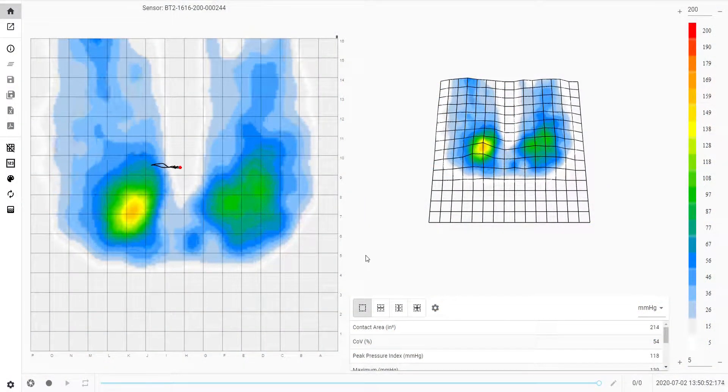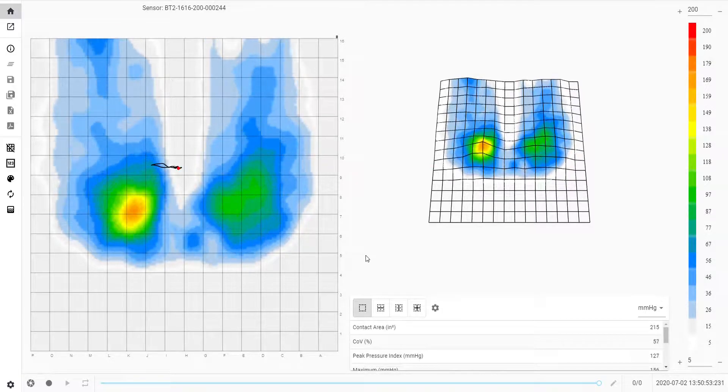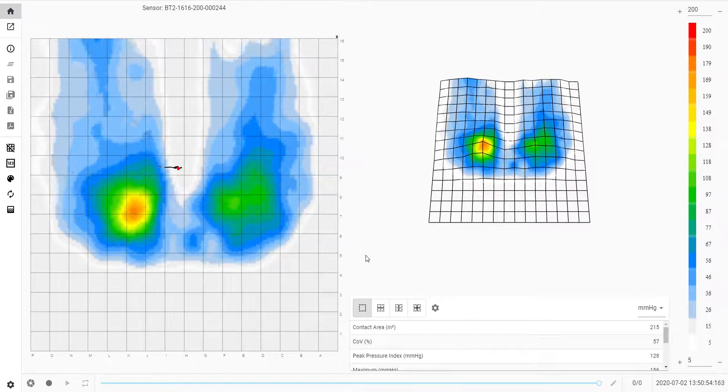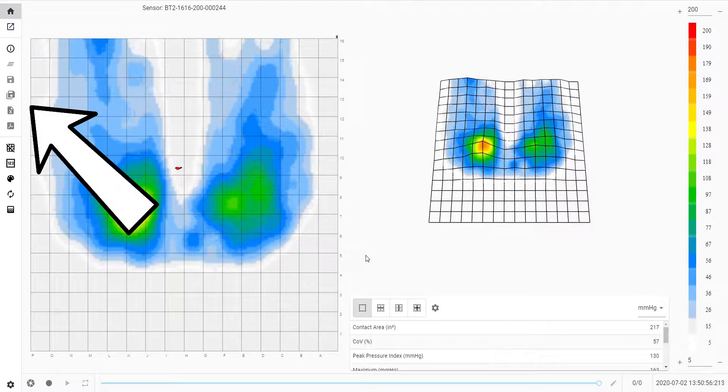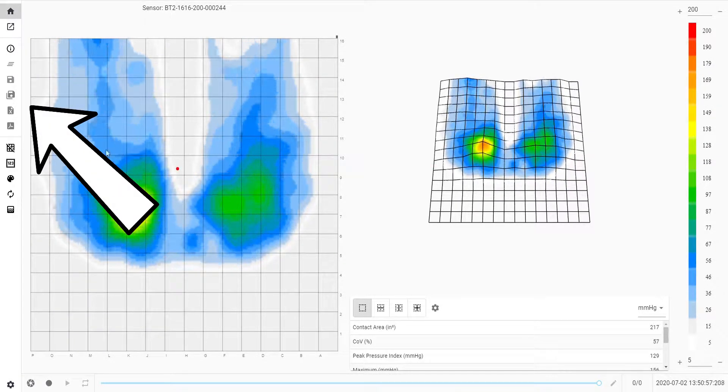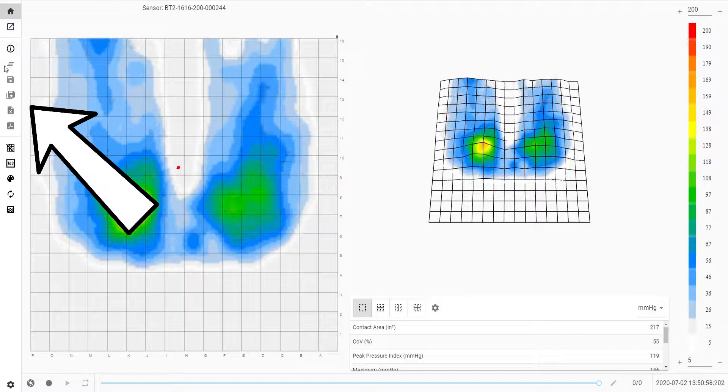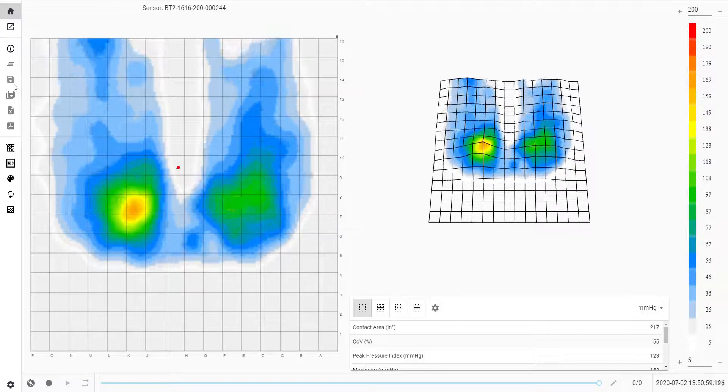You'll notice when you start up your BodyTrack Pro software that some of the icons on the left are greyed out, meaning they are unselectable, but we will touch on these later.